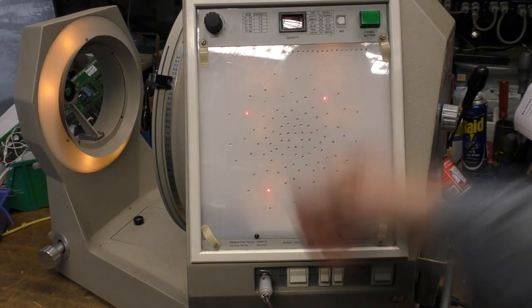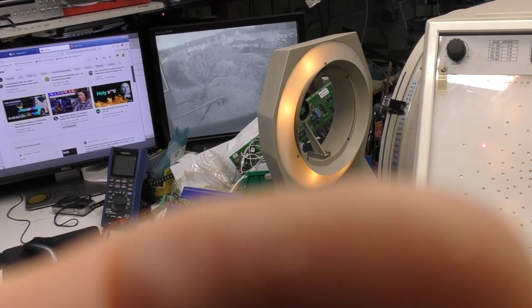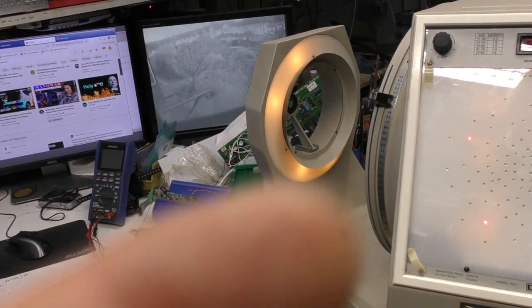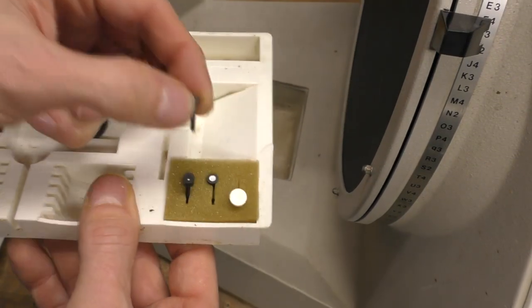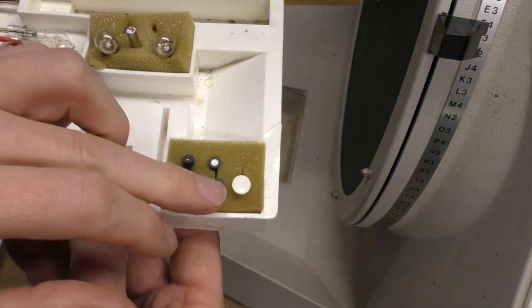And there's a light here which provides a bit of background illumination. Not quite sure what that's for. Maybe to help illuminate the crosshair. And down here there's just a little compartment with some parts and accessories. There's a few different crosshair markers for the centre, with circles of various diameters.